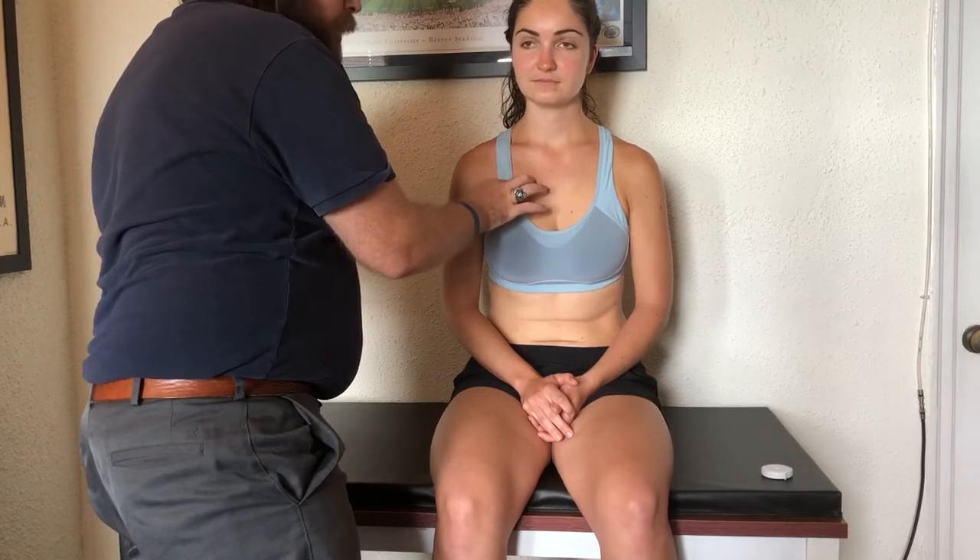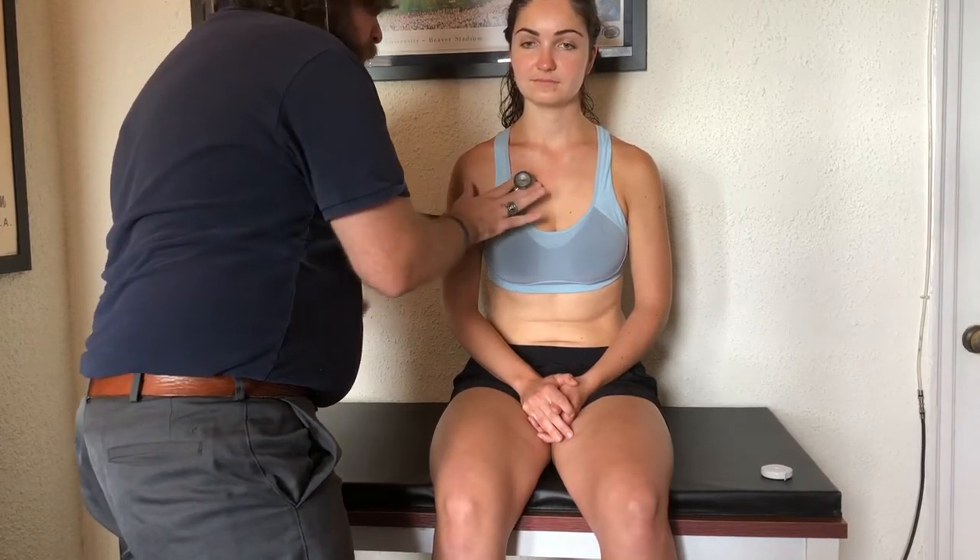We're going to find our angle of Louis by coming down to our manubrium and sternum — right here — second rib, second intercostal space, right parasternal border. We're going to listen through a full cardiac cycle. And her sounds are perfectly normal.